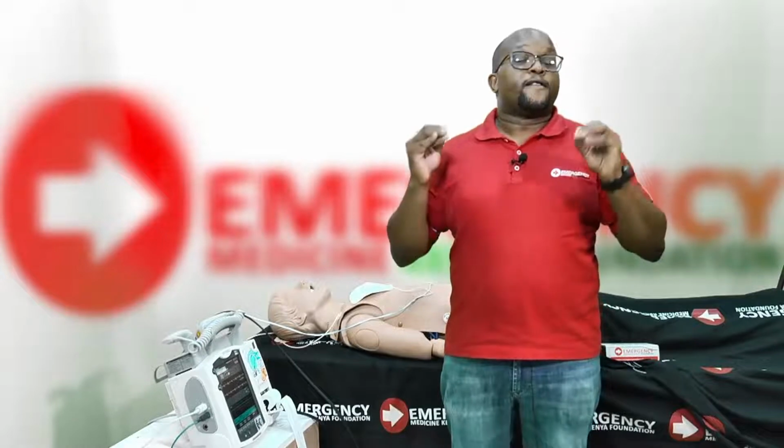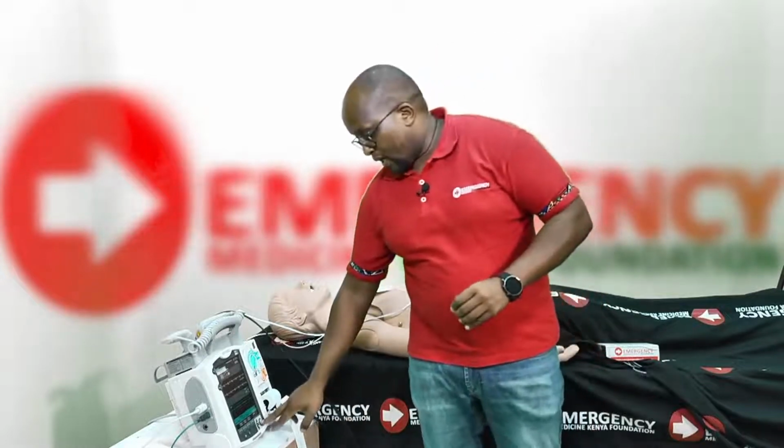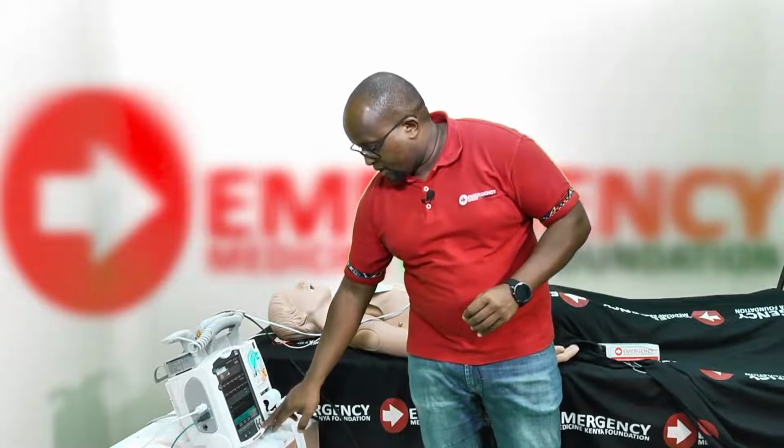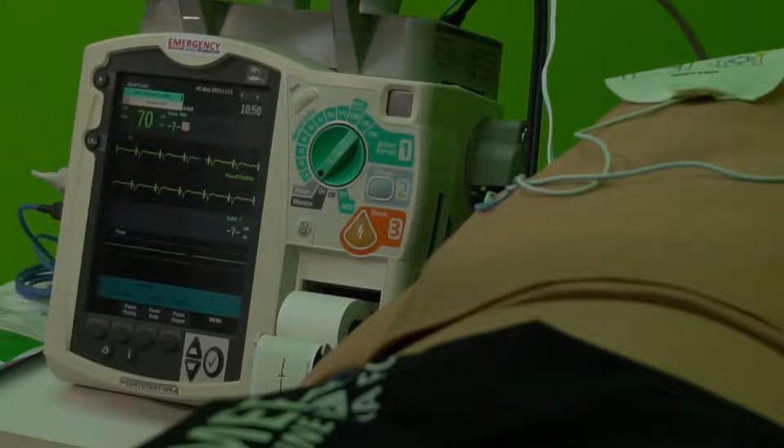Now, in the emergency department, or emergency care services, we'll normally use fixed mode. Why? I'll go here, pacer mode, and I'll put fixed. You can see now it reads fixed mode. Why do we use fixed mode in emergency care services?